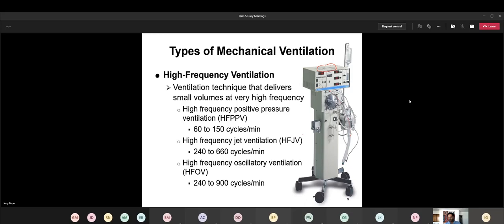And then just as another, there's our blender. Our air O2 blender is right here. And that just means that your yellow and your green line will have to be connected to the wall, and it goes through this blender.